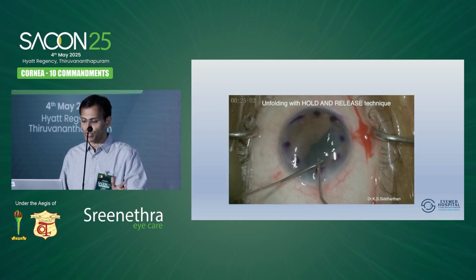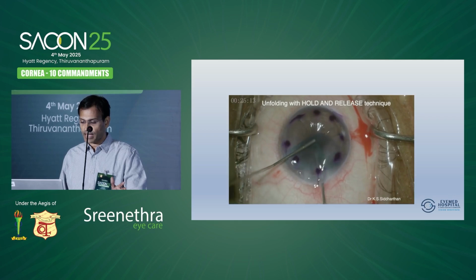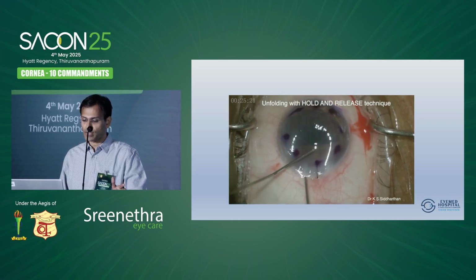I'm just trying to push it and make sure that it doesn't get caught in the tunnel. So I'm pushing it in. I am pushing it to one side. I'm shallowing it, making it horizontal. Again, pushing it into whichever position you want, very gently. Tap it into whatever position you want.